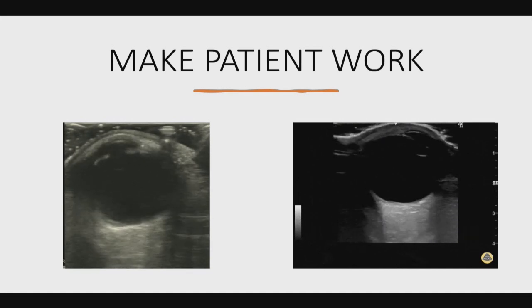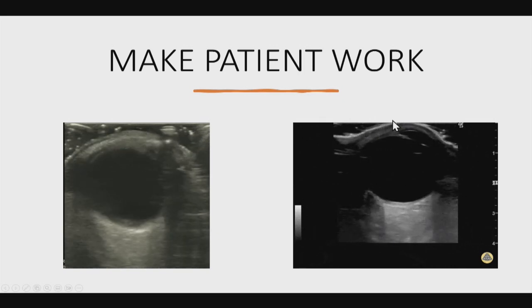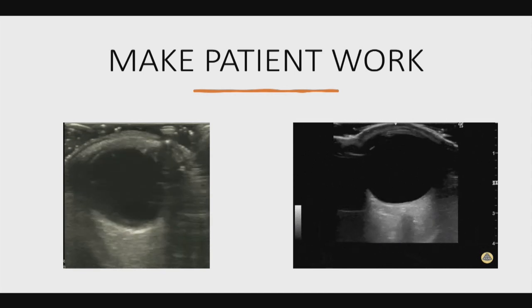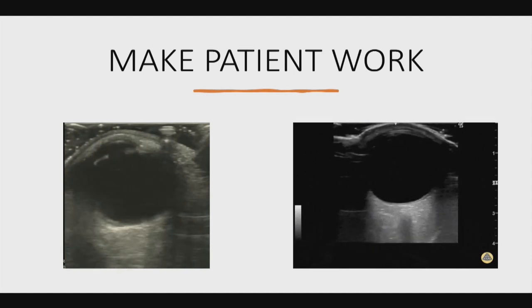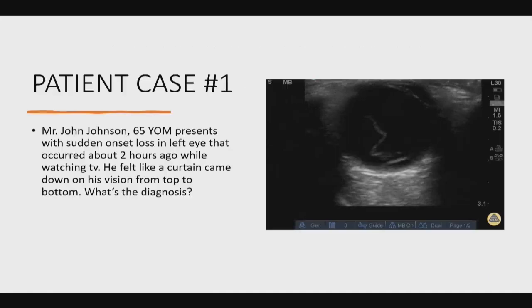Lastly, you want to make the patient work a little. All right, we all know about our fanning technique. We all know about our rocking technique, and you're definitely going to use that during the ultrasound. But making the patient move their eyes in different directions also helps you assess extraocular muscles and helps things move in the eye for you to be able to see what you need to see.